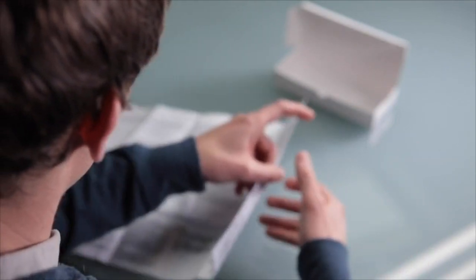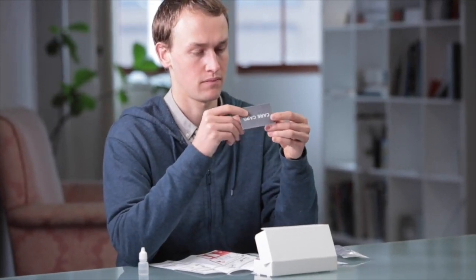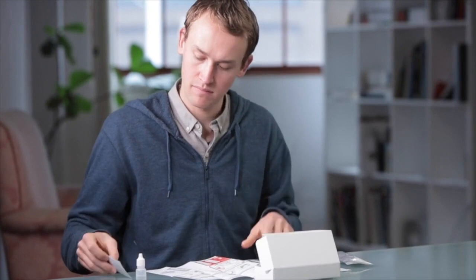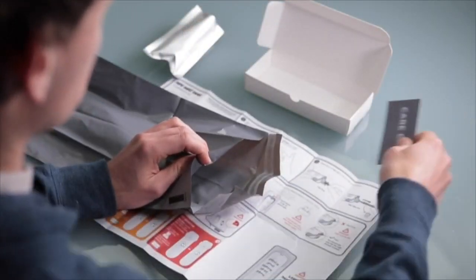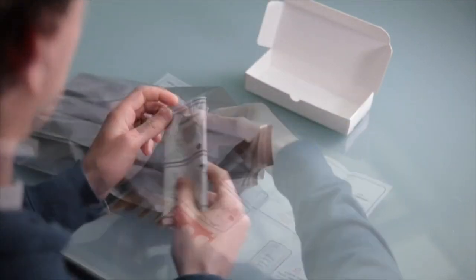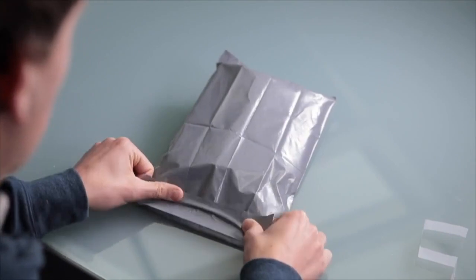More information about HIV can be found in the instructions leaflet, as well as support contacts that are available should you have any additional questions about HIV or require counselling, treatment, or follow-up tests and advice. Now that the test is finished, you can dispose of it by putting all the test materials in the plastic bag provided and placing it in a rubbish bin.